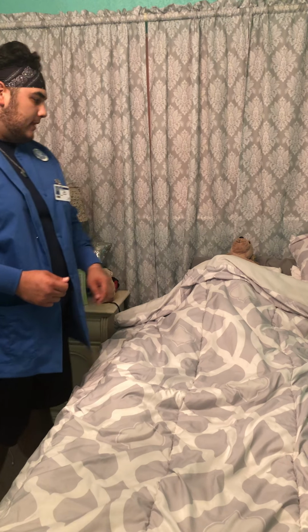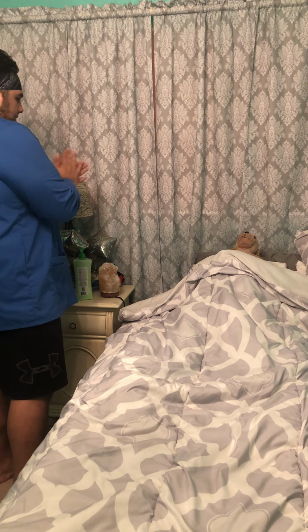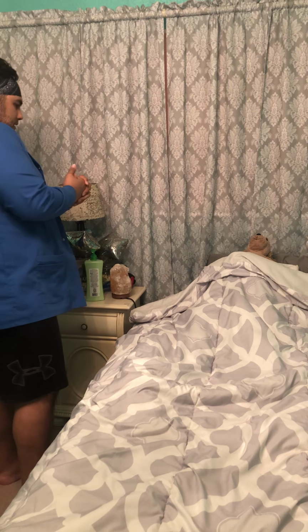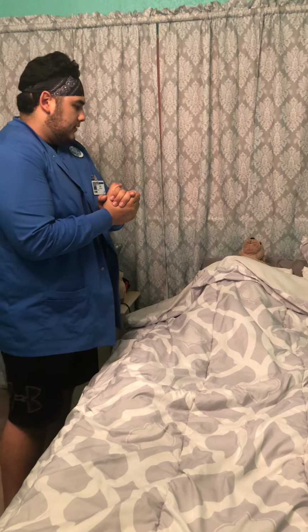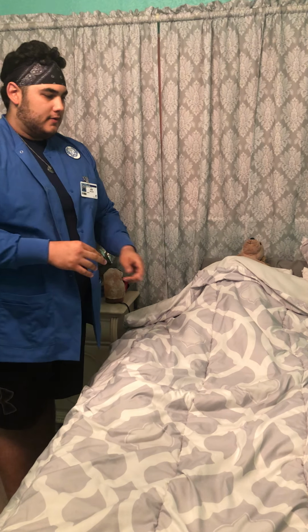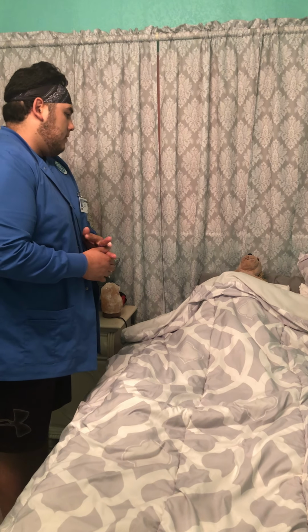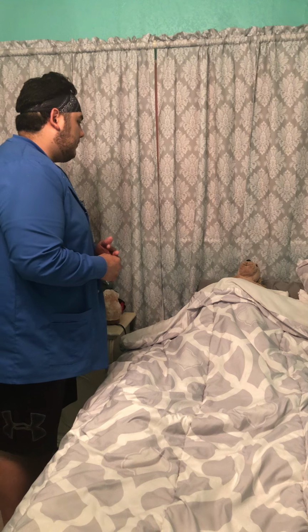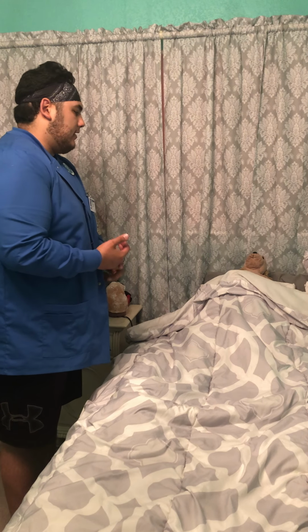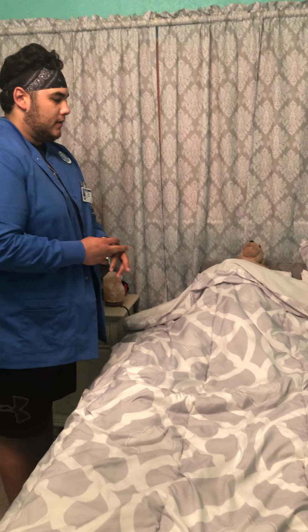And then we're going to go ahead and perform hand hygiene over here. And then, so after we do that, we want to identify the patient. So, ma'am, can I have your name and date of birth? Crystal Gann, 10/10/2000. All right, good. Are you allergic to anything, specifically to iodine or shellfish? No. All right, good deal.